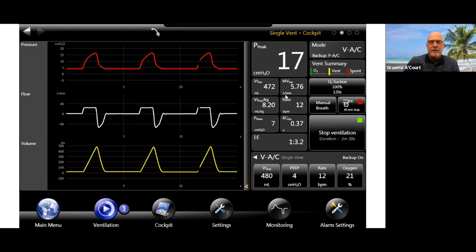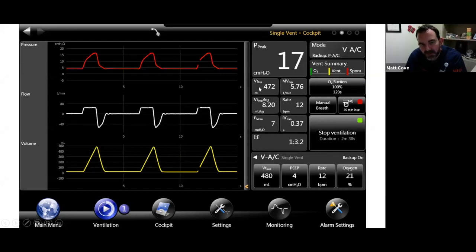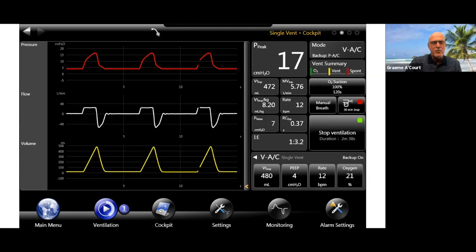Of course. Yeah. With the smoothing data, though, I would have thought with modern computing and GUIs now, you'd be able to show both, wouldn't you? Like a smooth line over the noisy background trace. That would be interesting to see, because then it would give us a sense of how much the smooth line is representing what's really happening. Yeah. Believe which one you want to, right?